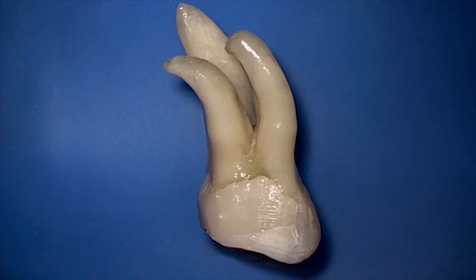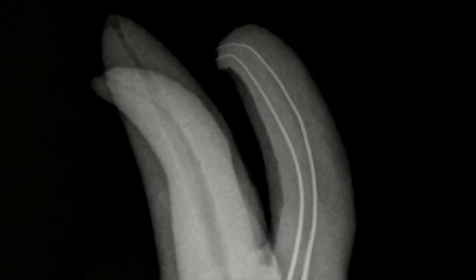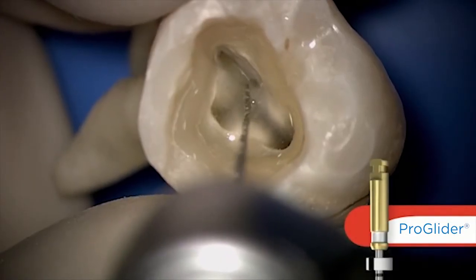Now the roots look relatively simple. You notice a little bit of curvature and maybe even abrupt curvature, but remember the canals are more curved than the roots that hold them. Quite a bit of curvature in the apical third.